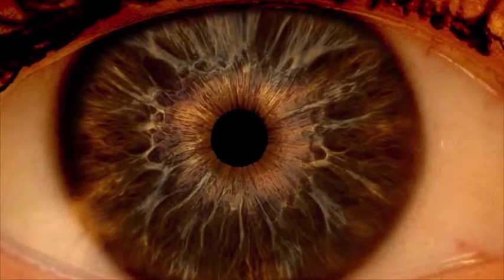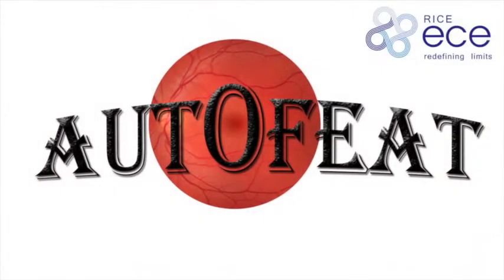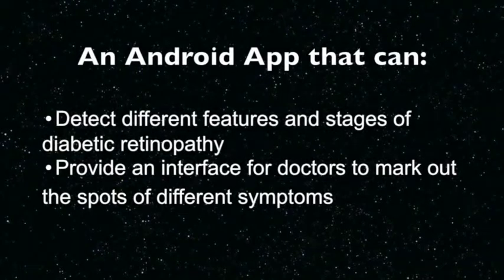Today, we introduce to you AutoFeat, an Android app that can detect different features and stages of diabetic retinopathy and also provide an interface for doctors to mark out the spots of different symptoms.